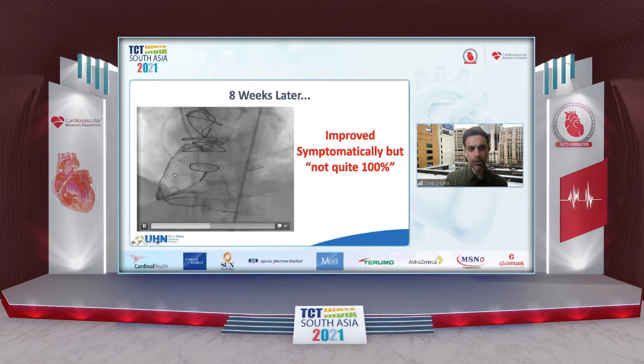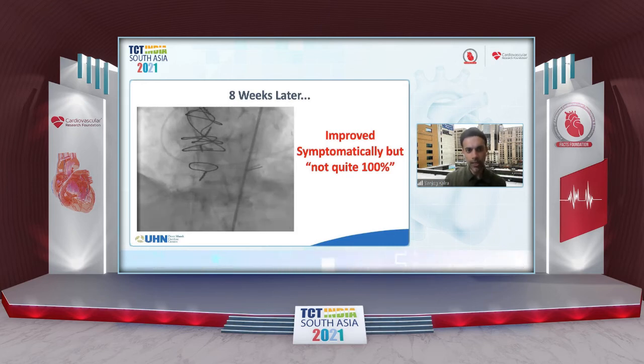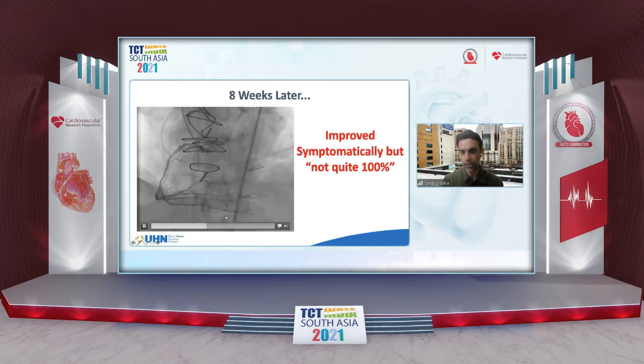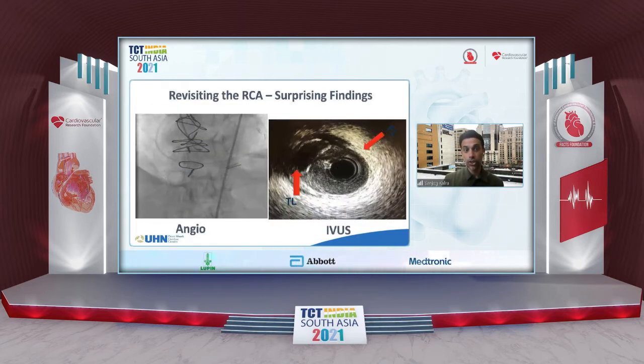So how do you manage this problem? Because if you stent in the mid vessel and you cover the entry point of this probably false lumen into this true lumen channel that then differentiates into multiple true lumen channels distally, it's like you're going to have to pick one of the kids, right? Where you're going to shut something down.